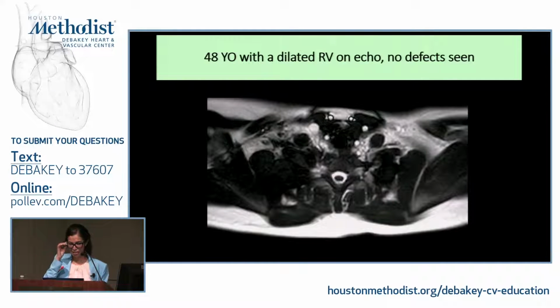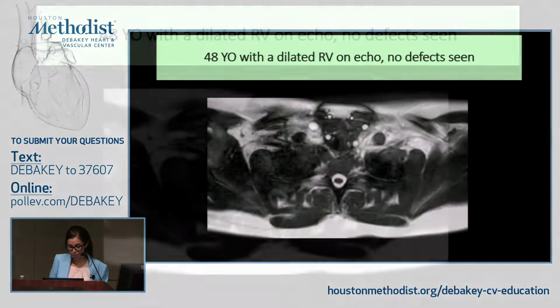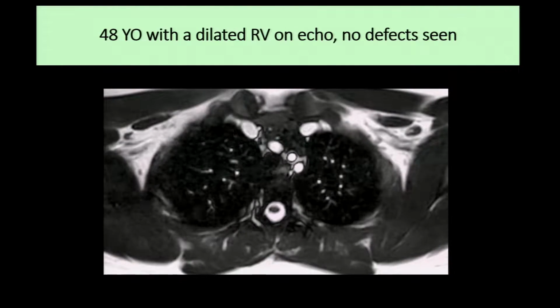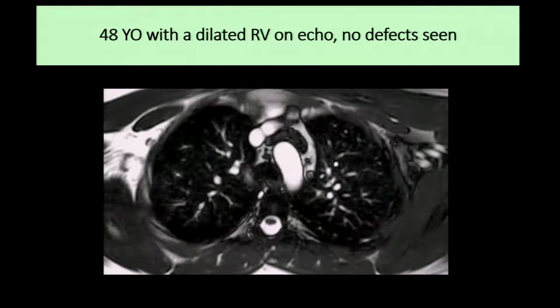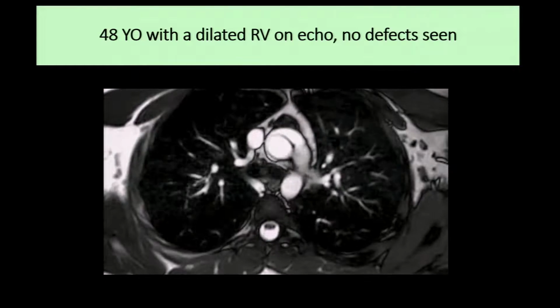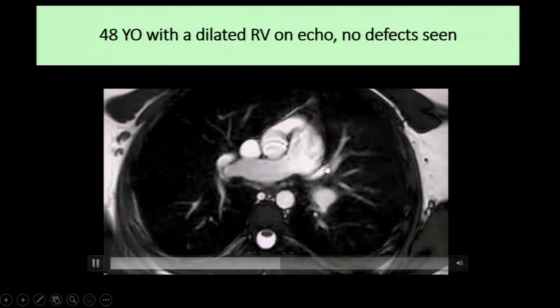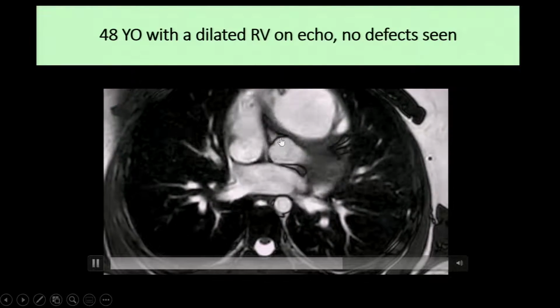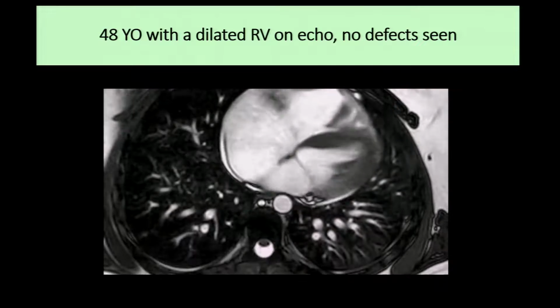Okay. All right. So let's look at this patient. This is a 48-year-old with a dilated RV on echo. However, no defects were visualized. So this is an axial stack, sinus stack. I love this, especially when I'm looking for defects that are undiagnosed. And as you can see here, we're going from superior to inferior. I played it once and we'll play it again.